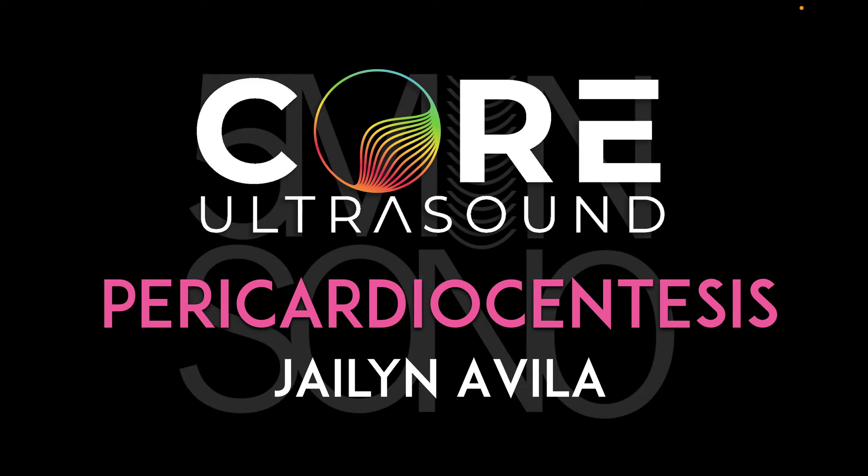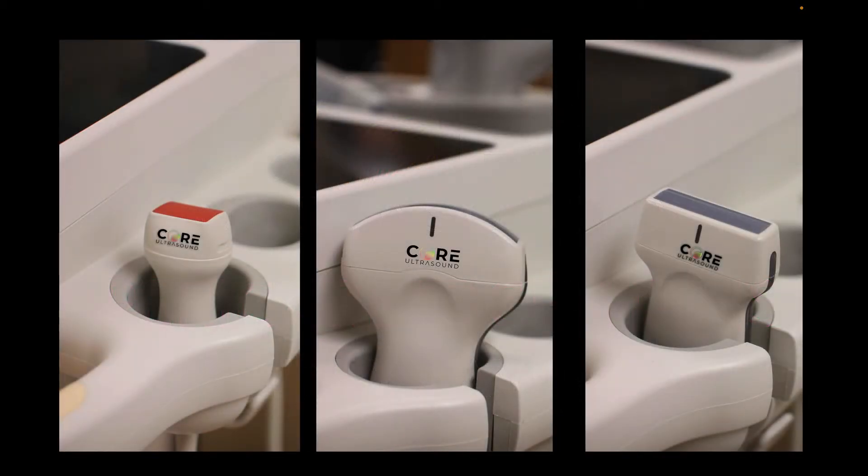Hello, my name is Jalen Avila, and in this 5-minute Sono video, I'm going to walk you through how to do an ultrasound-guided pericardiocentesis.